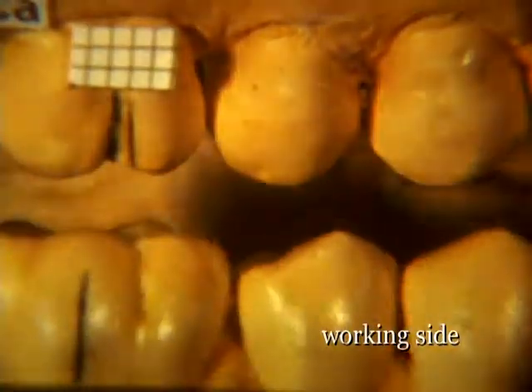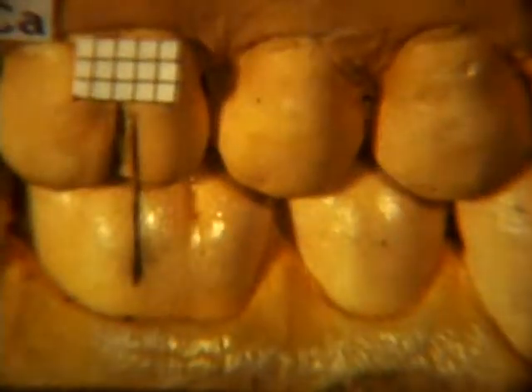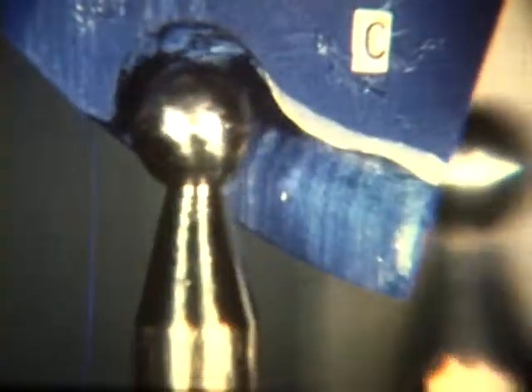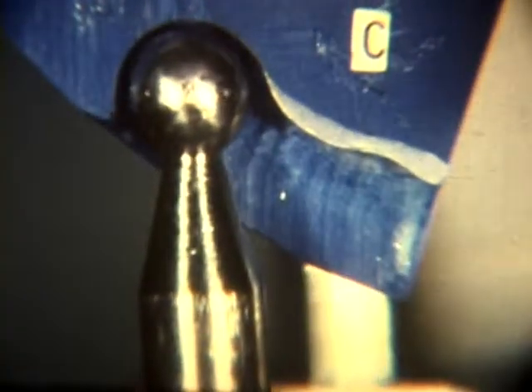Now the subject's teeth can be observed that were chewing the carrots just seen in the condylar movement series. The timing of the two condyles is clearly demonstrated in this view, showing the early return of the working condyle in the foreground and the lagging return of the non-working condyle in the background.